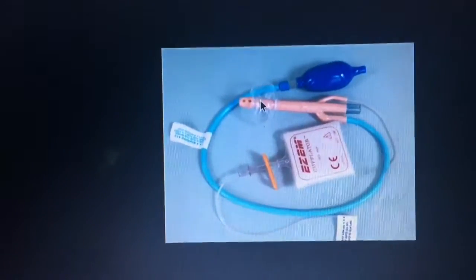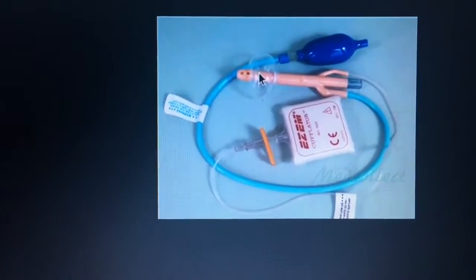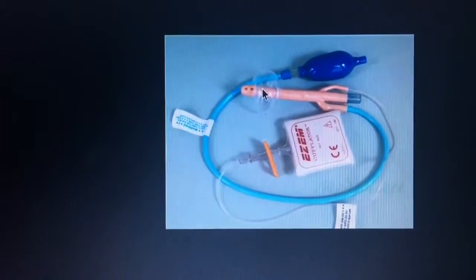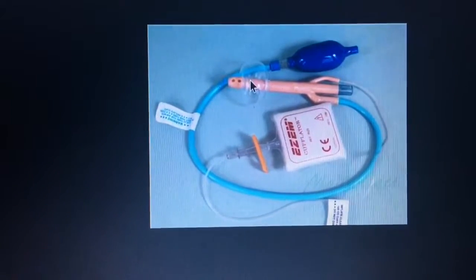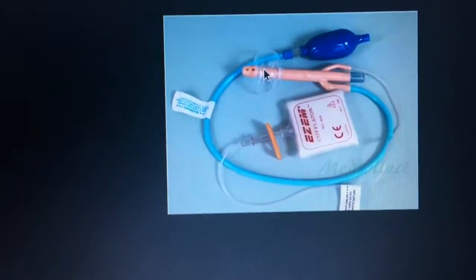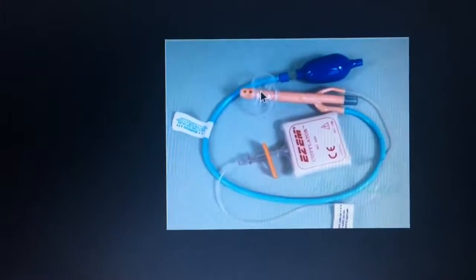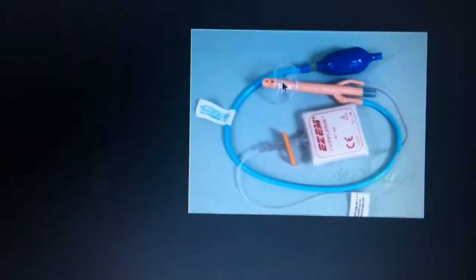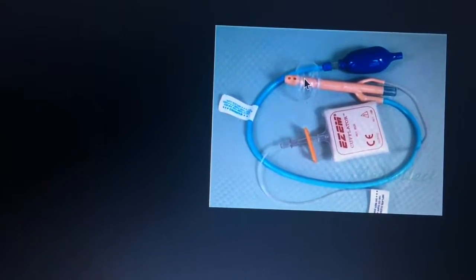And for the first image, before inserting the tip, we want to make sure that the patient has been properly prepped. They should have a clear large intestinal tract route. There should be no fecal matter. Also, you want to make sure that the patient hasn't had any surgery. Make sure that there isn't any perforation. Otherwise, we'd need to use Gastrografin or some kind of iodine that is water soluble. And I believe that goes over the first 7 minutes.